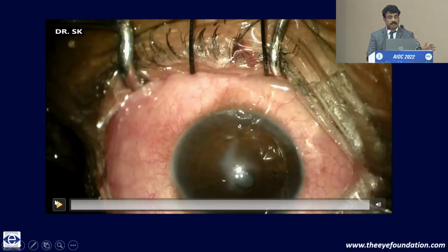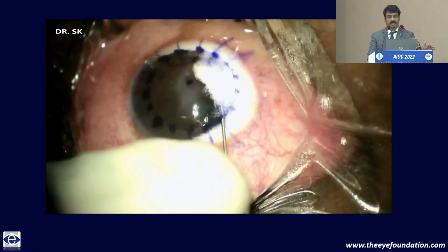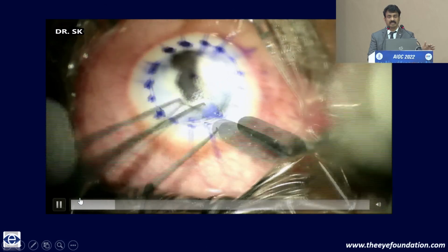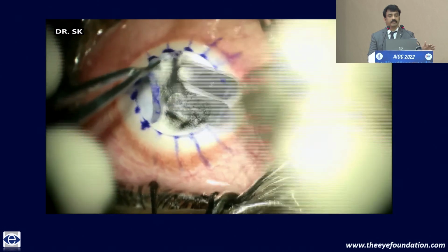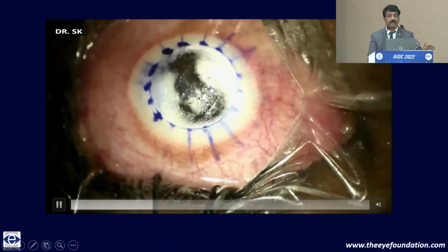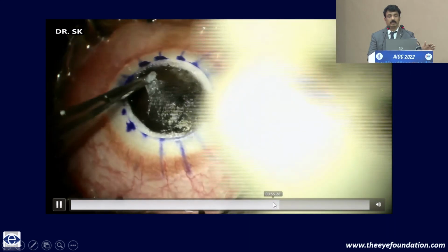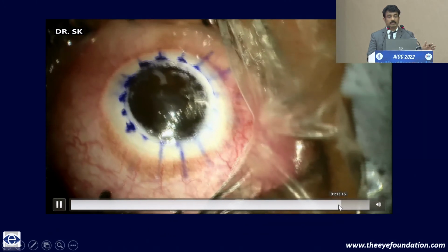The same patient. Here you know that there is a tear in the posterior Descemet's, posterior stroma. There is a scar. This is not for big bubble formation. This is just to create emphysema of the cornea, so that it helps in the dissection. And these multiple small bubbles give us a rough indication about the depth up to which we can go. So you can do a layer by layer dissection here manually, and go up to the predescemetic area and complete your DALK.